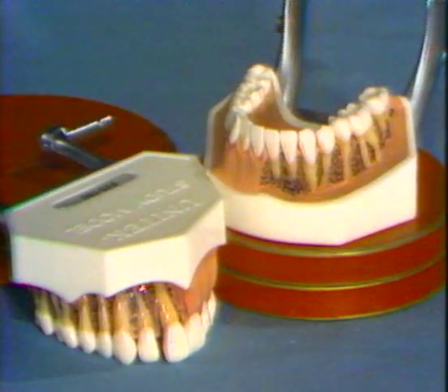In order that the viewer might better visualize the transferal of forces required in tooth removal, models simulating the adult maxillary and mandibular arches are utilized in this demonstration. For the purposes of this demonstration, the equivalent of the labial and buccal surface mucoperiosteum and the underlying cortical and alveolar bone have been removed from the model.